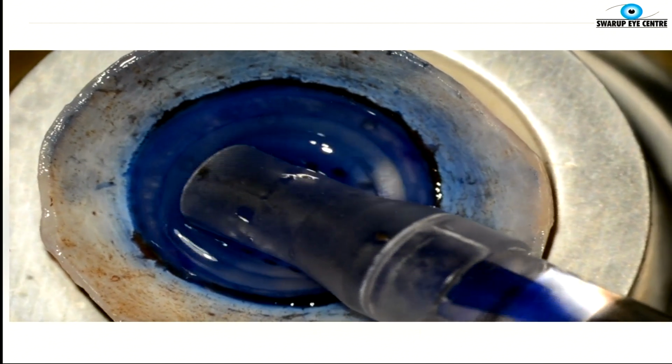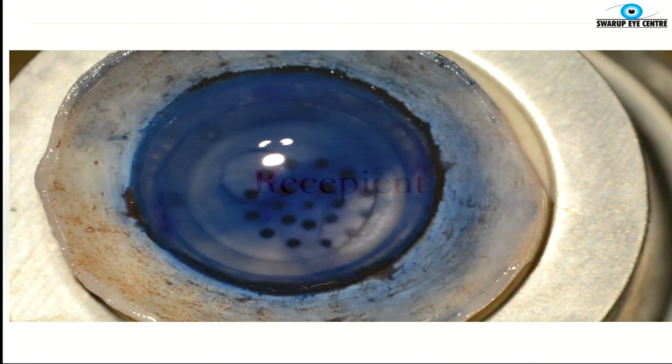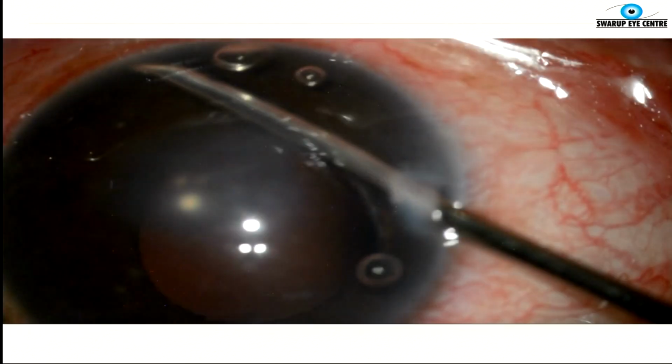So most of these DMEK injectors or cannulas have a broad end and a narrow end. So while drawing the tissue, you keep the narrow end towards the syringe and draw from the broad end. And once it's inside that injector, you can invert it and then inject with the narrow end facing into the anterior chamber. So that's what you do when you're in the recipient.